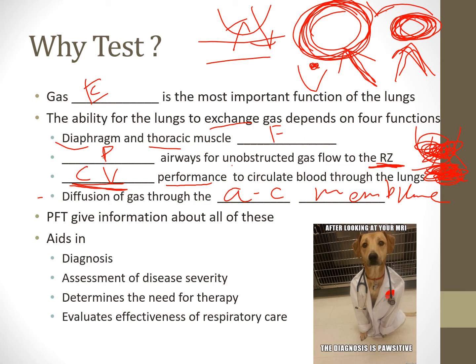carbon monoxide. Like I said, small percentage. You get more carbon monoxide at the bus stop, right? So very, very small percentage of carbon monoxide. And we have them breathe it in, hold their breath for about 10 seconds or so, and then exhale. And we're going to measure how much carbon monoxide we gave them, which is a known value, and then how much carbon monoxide they exhaled. If they exhaled almost everything that we gave them to begin with, that means hardly anything got diffused into the bloodstream. And you know carbon monoxide loves hemoglobin, right?